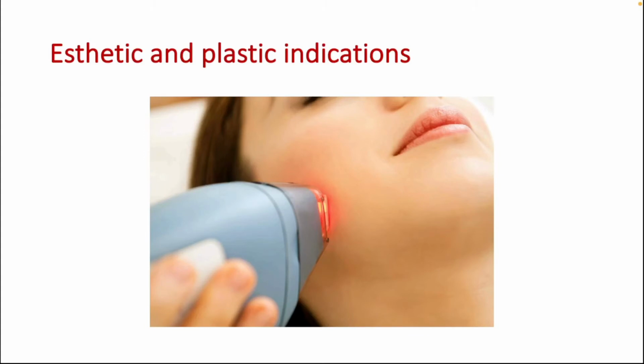And finally, lasers have been used in aesthetic and plastic indications. Superficial vascular and pigmented lesions are most commonly treated with the use of argon lasers, which are also used for treatment of deep vascular lesions and tumors. The carbon dioxide laser is indicated for vaporization of exophytic lesions.